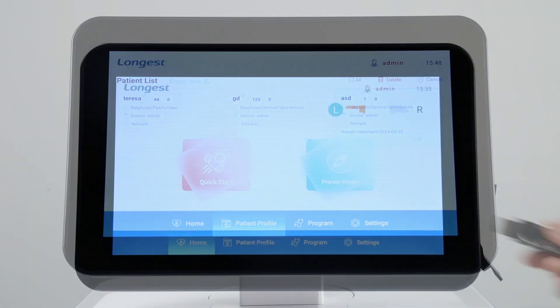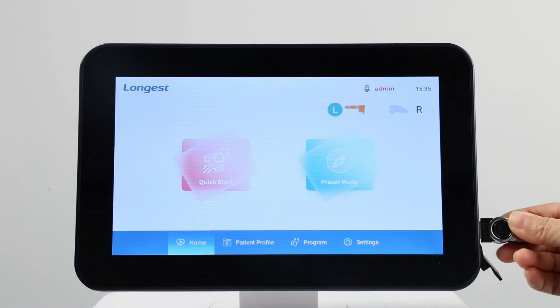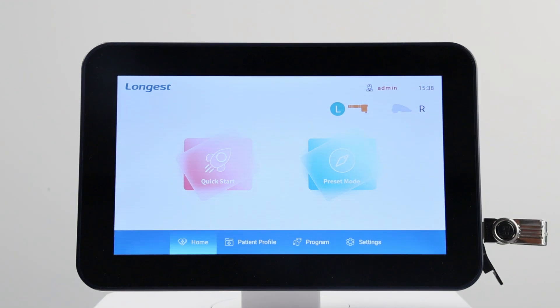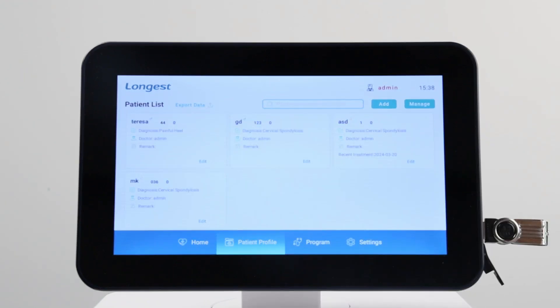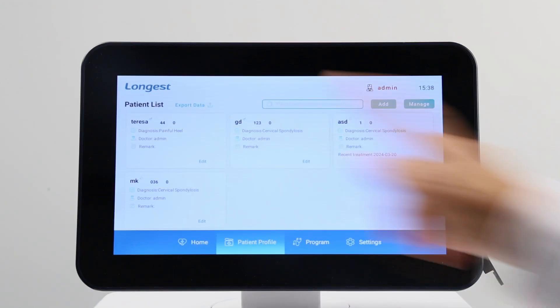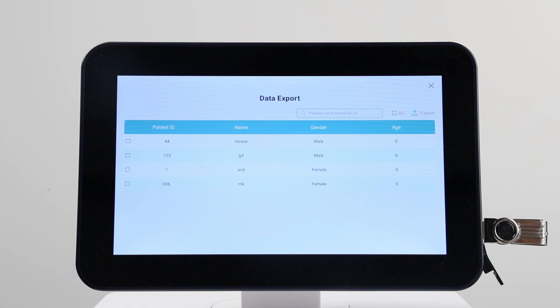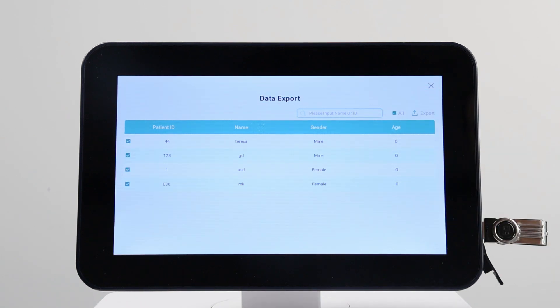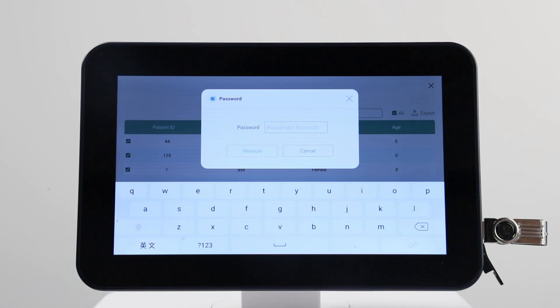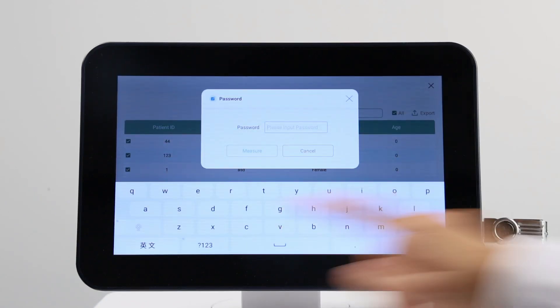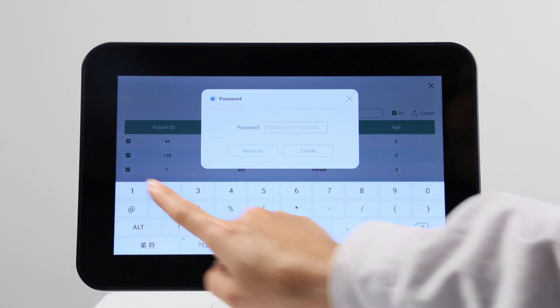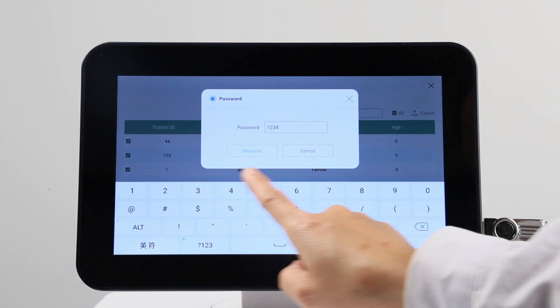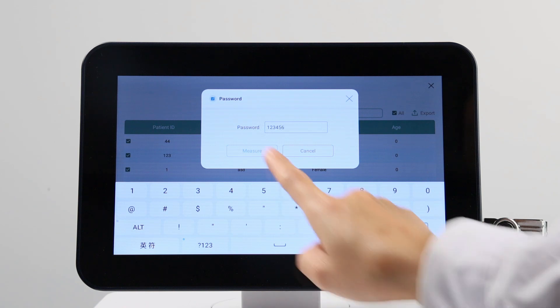You can also export the patient information via USB. You need to enter account password to export the patient information.